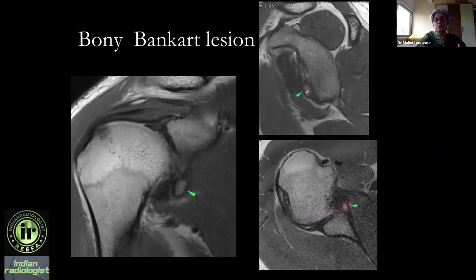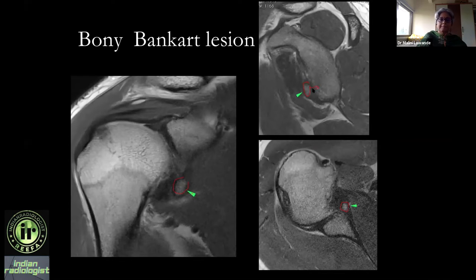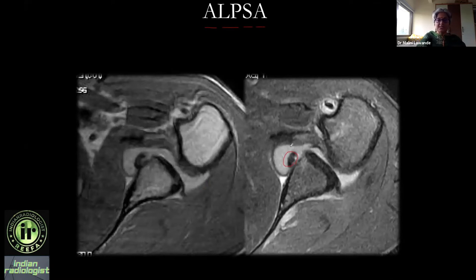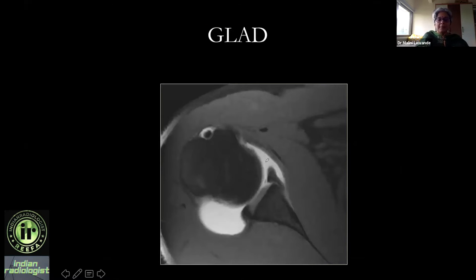Also check whether there is a bony fragment associated with the labrum. Non-fat-sat sequences help here. This is a bony Bankart lesion — not only the labrum but a piece of bone has come off with it. Give the size of this bone. Has the labrum displaced medially? That is called an ALPSA — anterior labral periosteal sleeve avulsion.